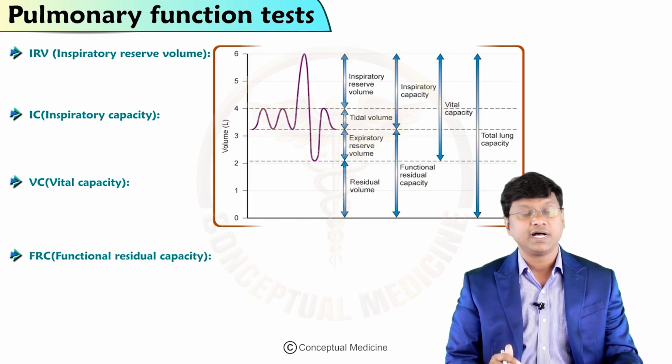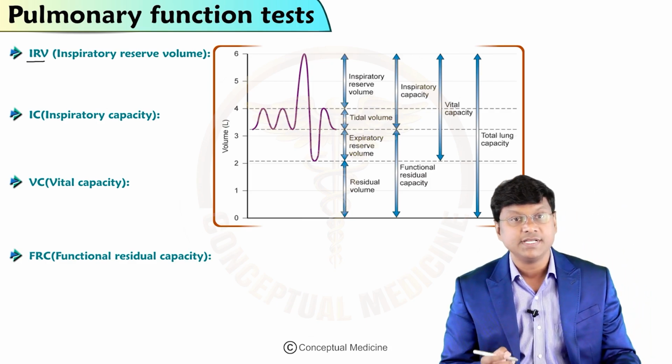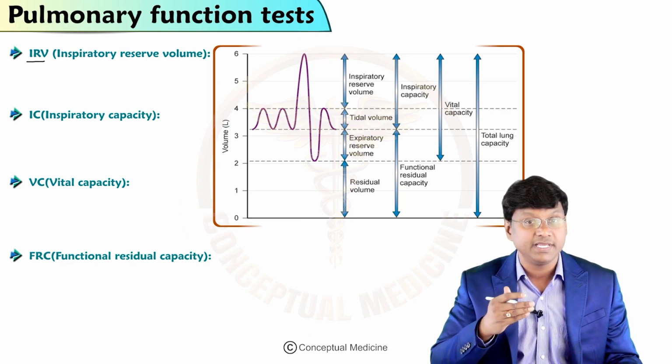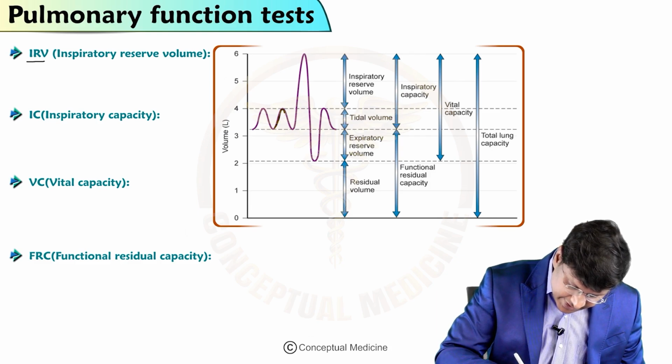Then coming to another important terminology, that is inspiratory reserve volume. How do you define this? See, inspiratory reserve volume, it is the maximum volume of air that can be inhaled. You see here, this is the inspiration and this is the expiration. And this is the inspiration.